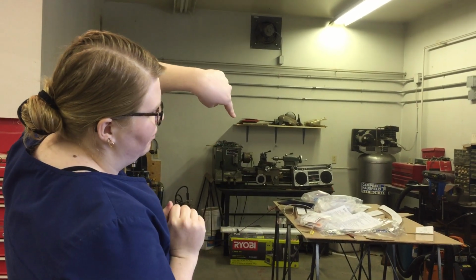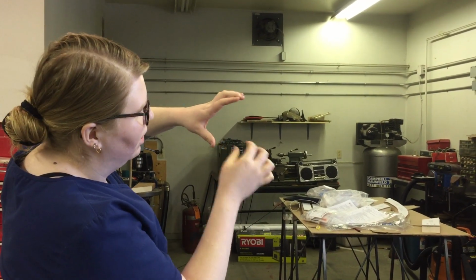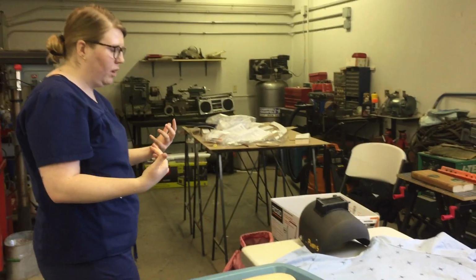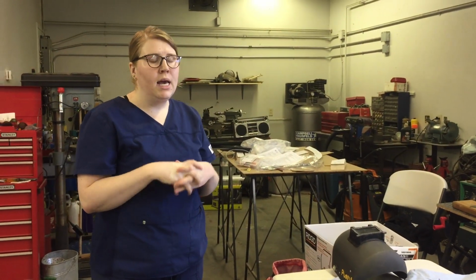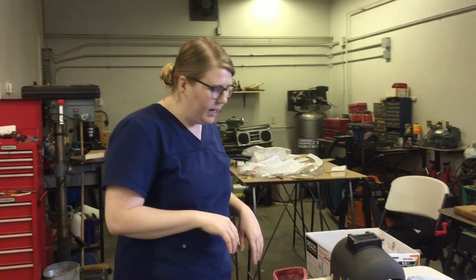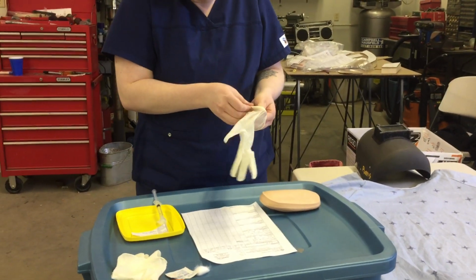So I would obviously remove my hands because that would be dangerous, and in clinical practice, I would landmark by cleaning the spot and then leaving my alcohol swab there so I knew exactly where I landmarked. So after I've done that and I've landmarked and the patient has given me cooperation that they are okay with all of this, I'm just going to note that I have checked my hospital's policy and I'm not required to aspirate, but I just want you to know that I did check the hospital policy, so I'm not going to be aspirating today. So at that point, I'm going to go and I'm going to wash my hands and I'm going to apply my clean gloves.